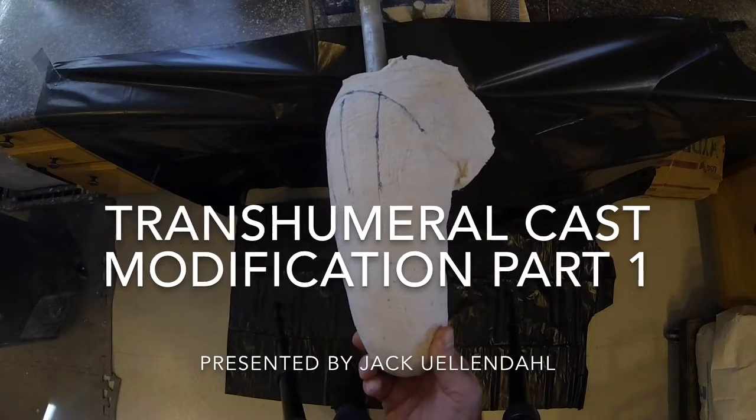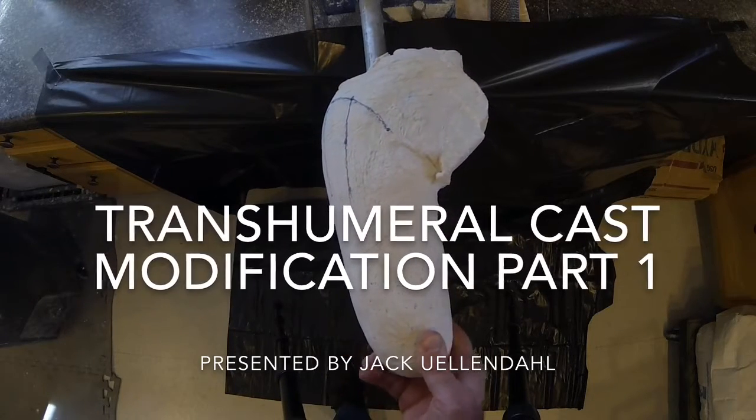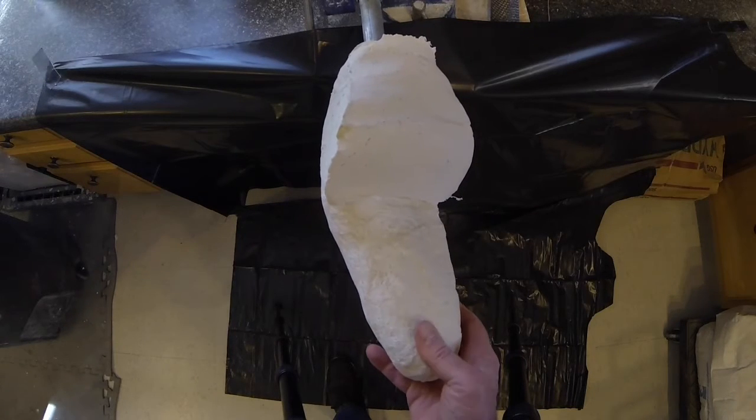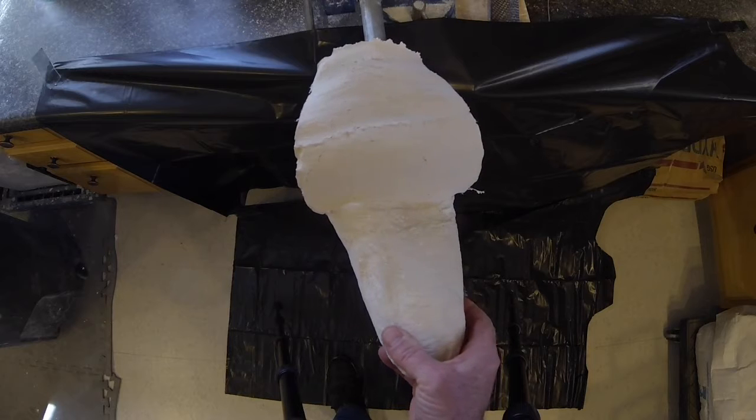This video presents the plaster modification procedure for the transhumeral prosthetic socket. Here we see the plaster model after the plaster bandage wrap cast has been removed.